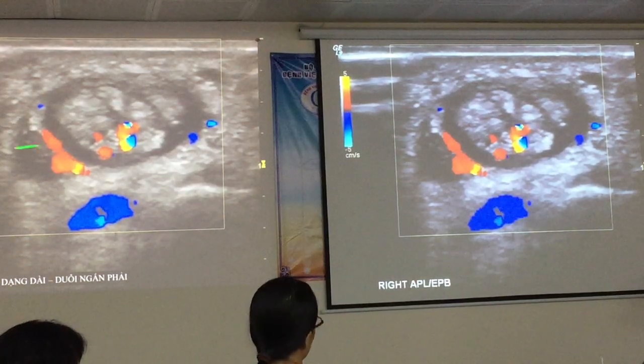And this is just the orientation of the tendon fibers. That's not partial tearing within the tendon.